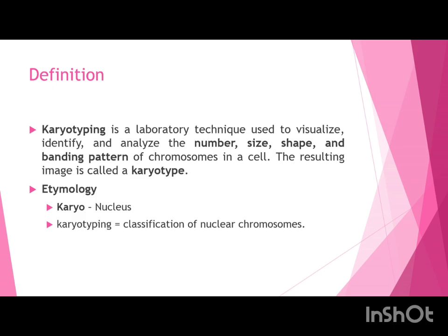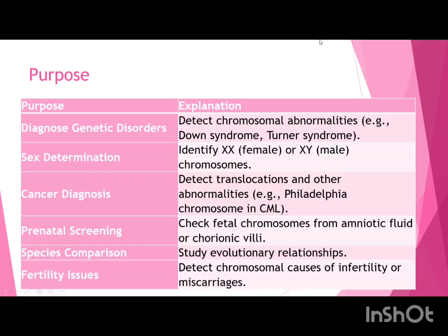We know that the chromosomes can be stained. I have already talked about 6 types of banding patterns which we can observe in chromosomes, and all those can be classified. When we match the chromosomes of two persons, the number and the size of the chromosomes will be similar, banding pattern will be similar, but it is not exactly 100% matching.